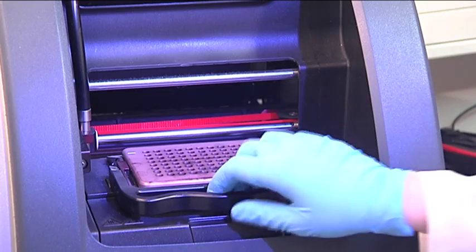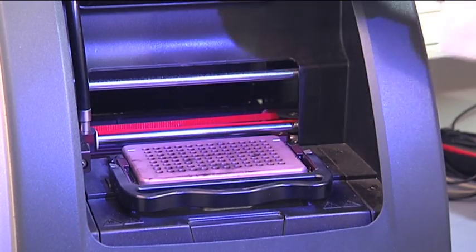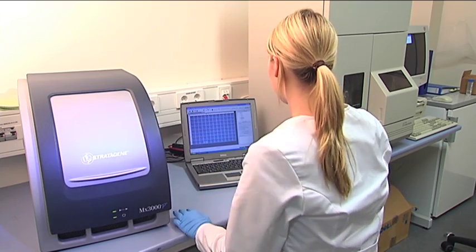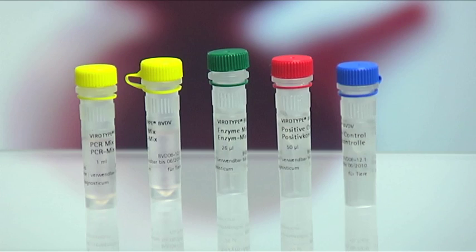Now real-time RT-PCR analysis is carried out. If the results are positive, the individual samples of the positive pools are tested again with the Viro-type BVDV test kit. If the findings are negative, retesting isn't necessary.